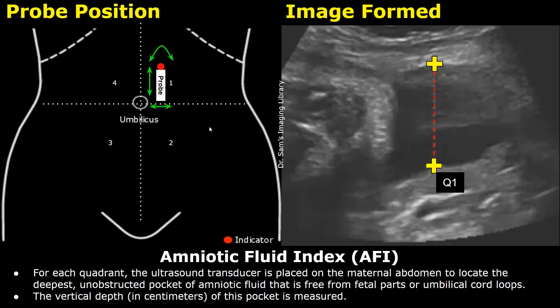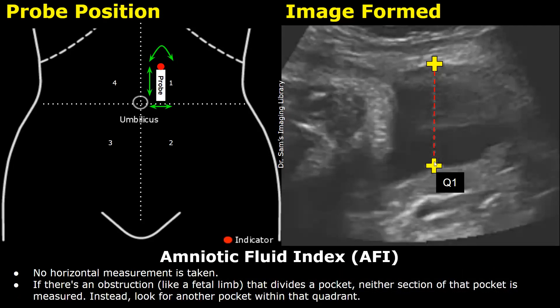For each quadrant, the ultrasound transducer is placed on the maternal abdomen to locate the deepest unobstructed pocket of amniotic fluid that is free from fetal parts or umbilical cord loops. This vertical depth is measured in centimeters. Only the vertical measurement is taken — do not take any horizontal measurements. If there is any fetal part or umbilical cord present, do not measure that pocket; look for another pocket within that quadrant.